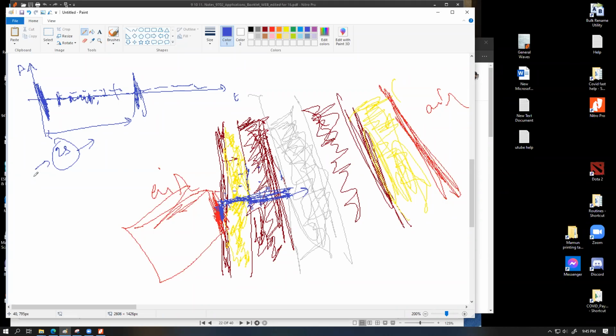So the amount of distance that you need to cover over here is bigger. To accommodate for that much distance, we need to send these pulses less often. Less often means with a bigger time gap. So depending upon what exact part of the body we are scanning, we can calibrate how often we are going to send those pulses.